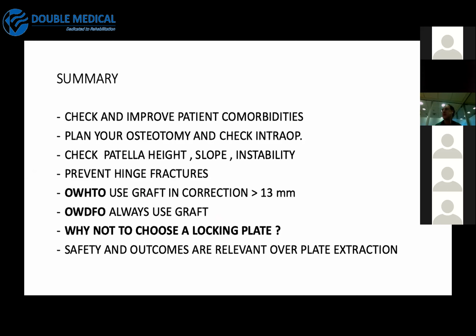Lastly, why not choose a locking plate? If the evidence shows that a better plate allows you to mobilize your patients quickly and with more security, you need to choose a locking plate. And safety and outcomes are more relevant than plate extraction.